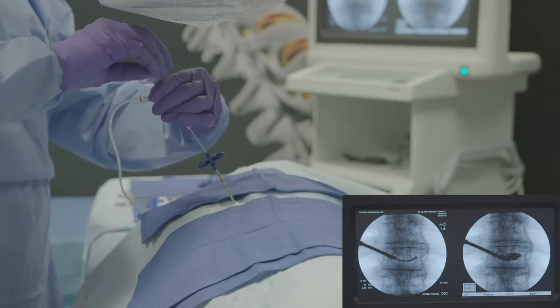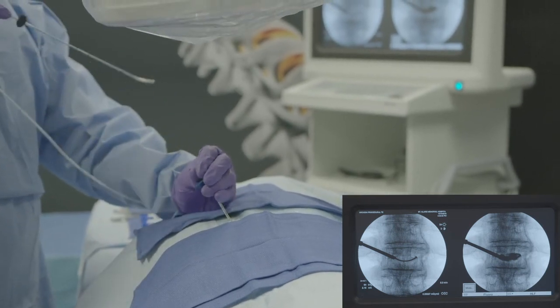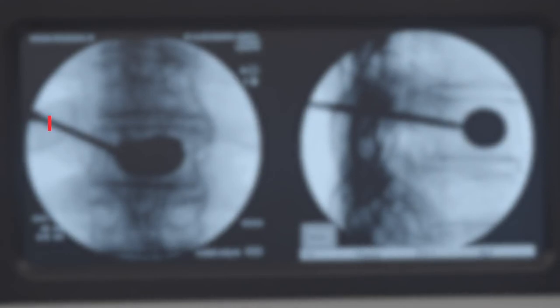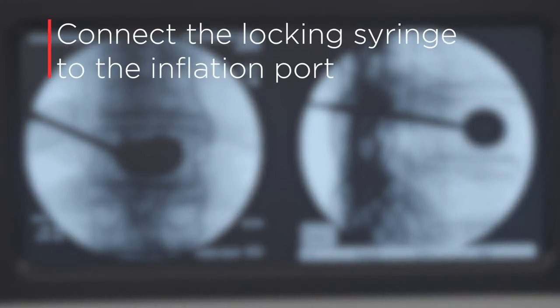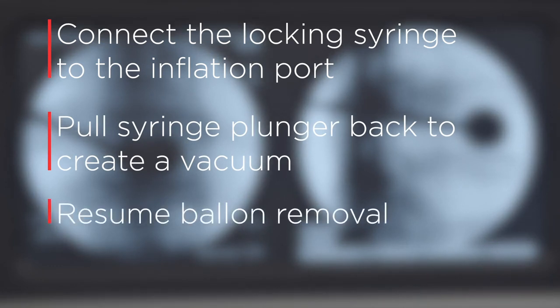Remove the Arcadia Balloon Catheter from the bone with a gentle motion. If there is resistance, connect the locking syringe to the inflation port, pull the syringe plunger back, locking it to create a vacuum, and resume the balloon removal.